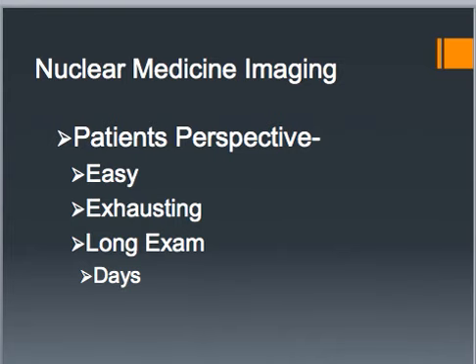So when it's time for the imaging, the patient just has to lay on that table, and then, like I said, that table will move in and out of that gantry or the hole. And then the scanner is going to take a series of images. Like I said, it's going to rotate around that patient, and it could get fairly close to the patient. The patient needs to remain still. So that could be a problem if the patient is unable to lie still for the exam, because we do need to acquire those pictures without the patient moving.